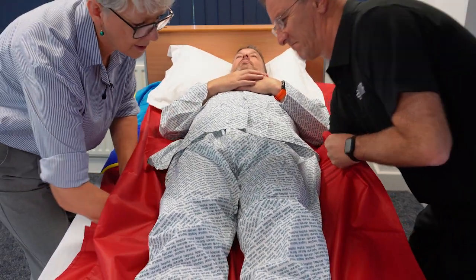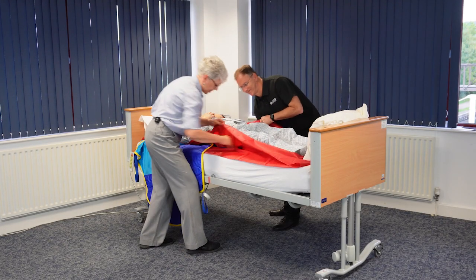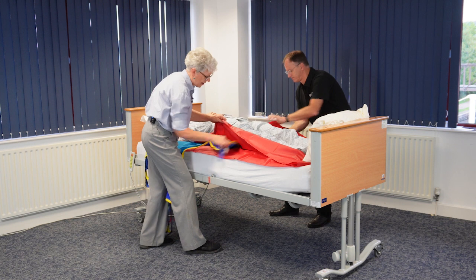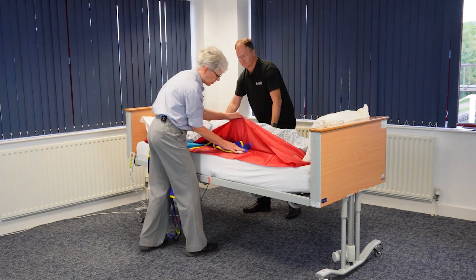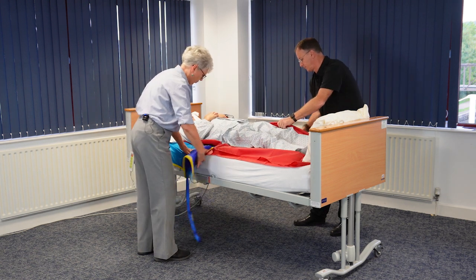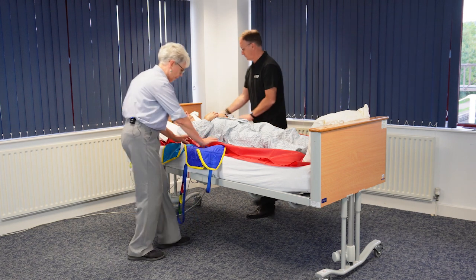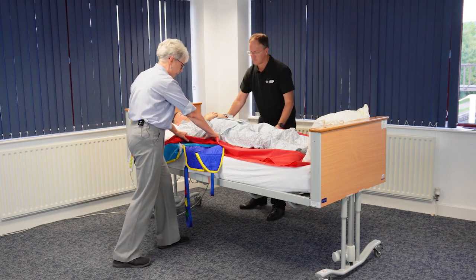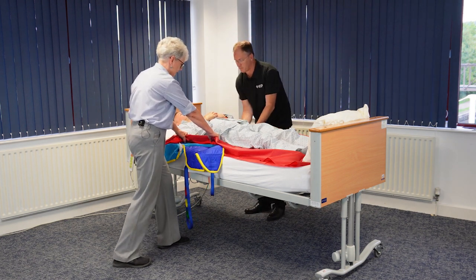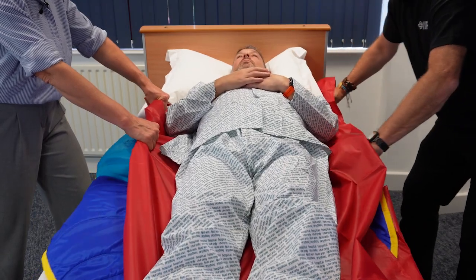Just go down a little bit. Then the hip loop I'm going to pass underneath and bring that through, and then also the leg loop — just pass that through if you could grab the leg loop. So we're just bringing that through. Now to make sure that Colin doesn't move too much, I'm going to hold the top layer of this tubular slide sheet while Chris brings the sling gently through.